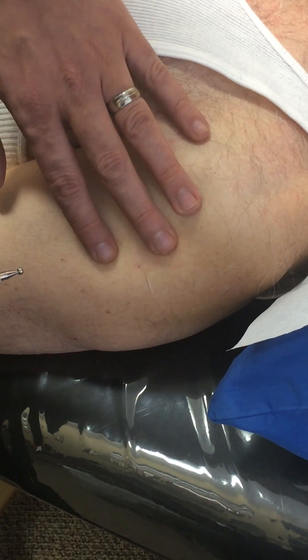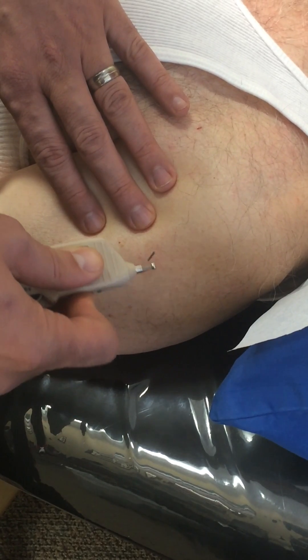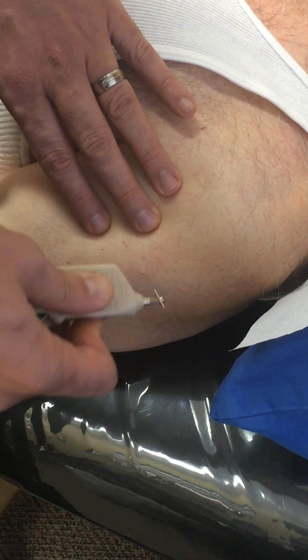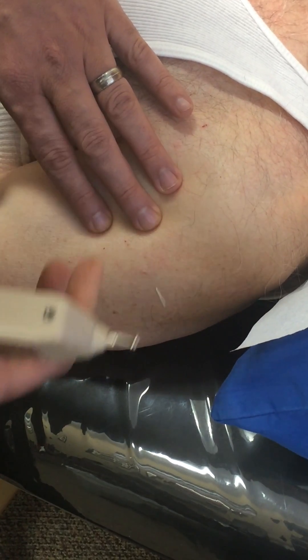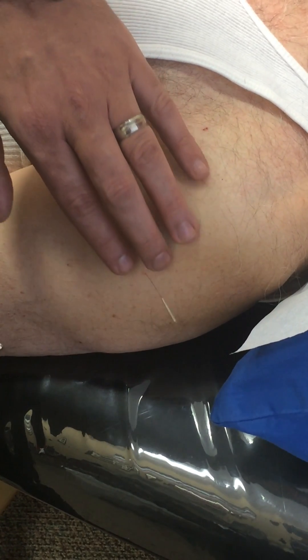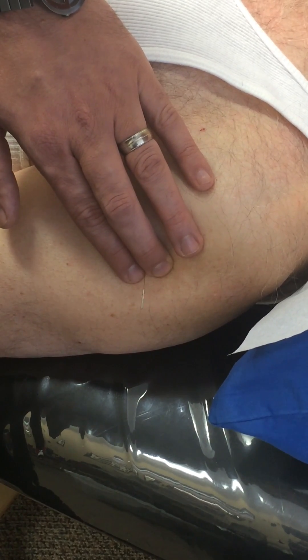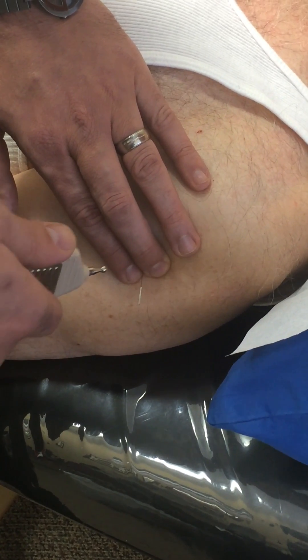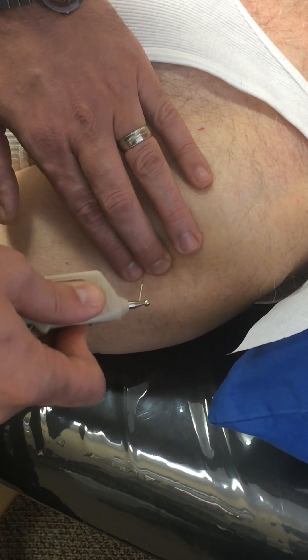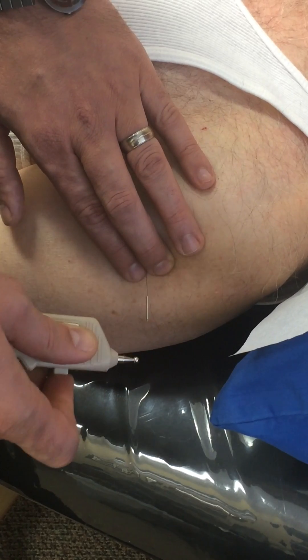If you're not putting enough pressure with your non-dominant hand — if you're out here — you'll still get a contraction; in this case the deltoid is an easy one to elicit. But if you're in the glutes or in the quadriceps, you really need to make sure your non-dominant hand is applying pressure, directing the needle closer to that neuromuscular junction, so when you stimulate it you can get a clean response.